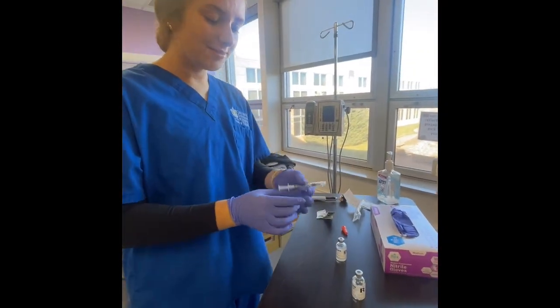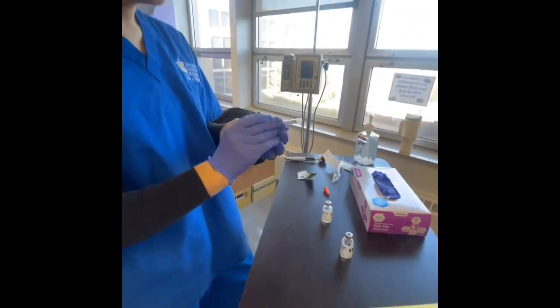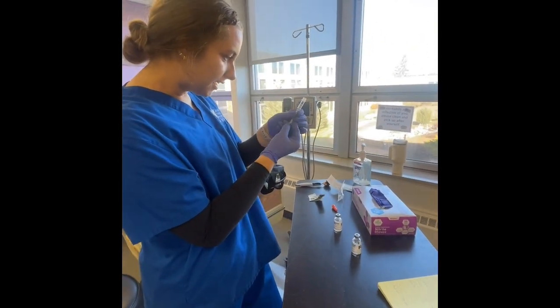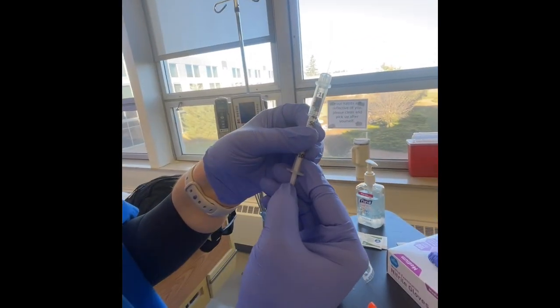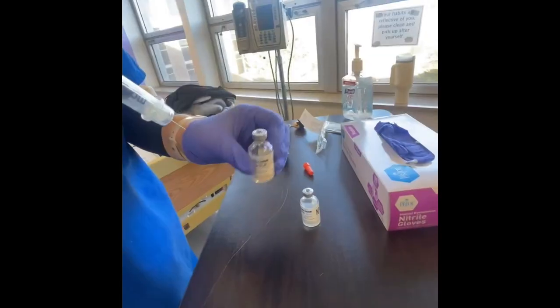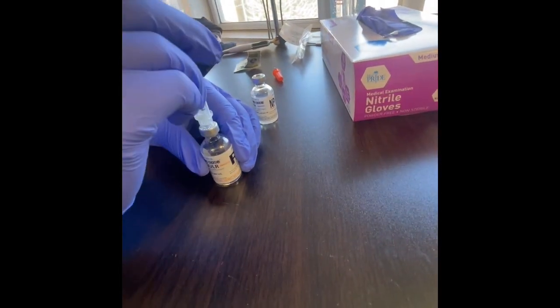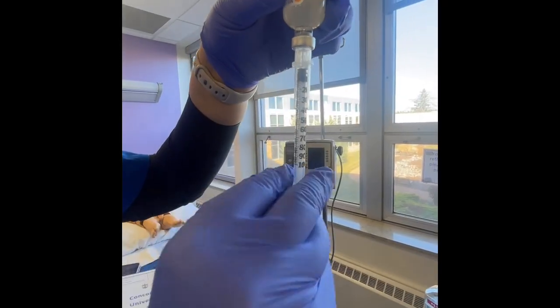Be very careful. Then just inject the air. Then 14 units, which can be kind of tricky sometimes with the safety in the way. Air goes into the regular, and now we're going to draw up 14 units. You want to make sure there are no air bubbles.